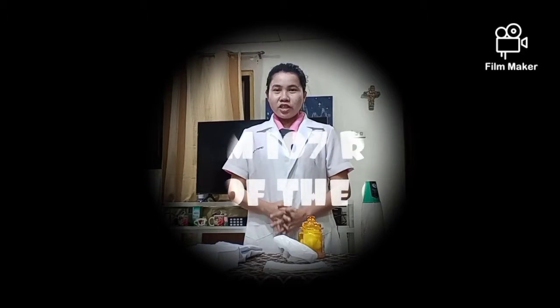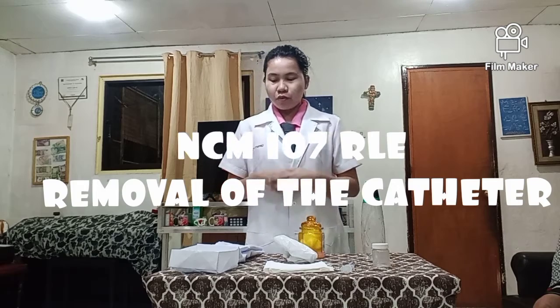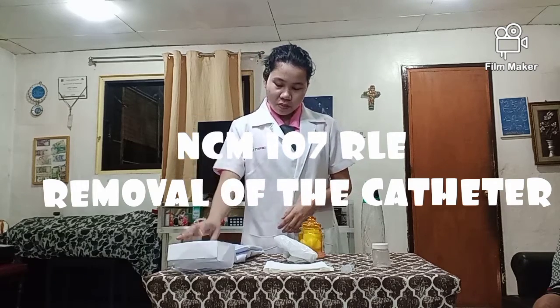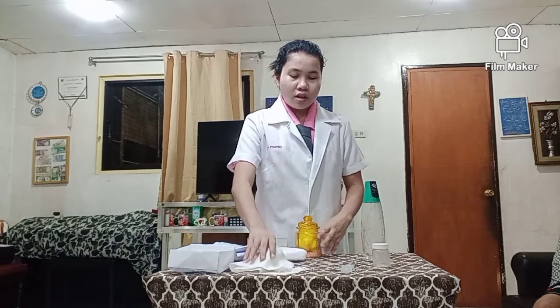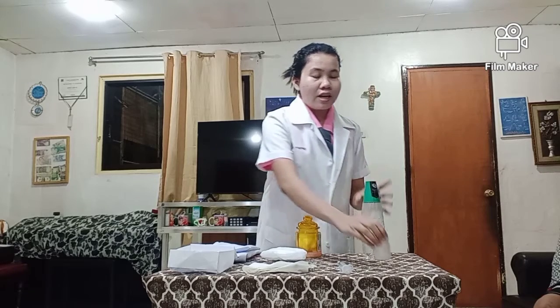Then do aftercare. First, prepare all the materials needed for the removal of the catheter: a waste receptacle, the bath blanket, wet cotton ball, plastic container, tissue paper, a syringe with needle, the 10cc syringe, another plastic container, and lastly a urinal bottle. These are the materials needed for the removal of the catheter.